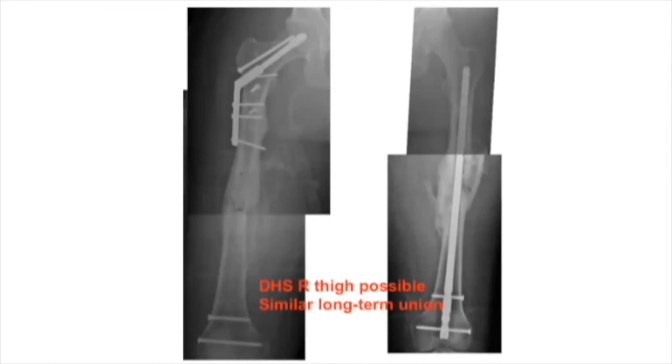Have you changed your weight-bearing status in some of these? Yeah, so the distal femurs, like those distal femurs, that's just one of them. I've done, I think, 4 or 5 periprosthetic total knees, and all of them I've allowed to weight-bear about 6 weeks sooner than I usually do. Usually I let them weight-bear not until 12 weeks. Now I'm letting them weight-bear at 6 instead. Just because I'm feeling a lot more confident, and so far I've not seen any failures with those.